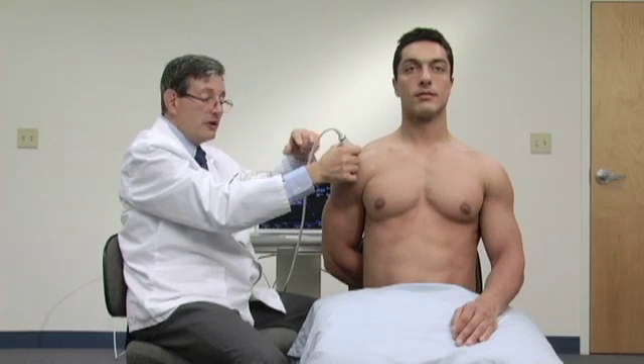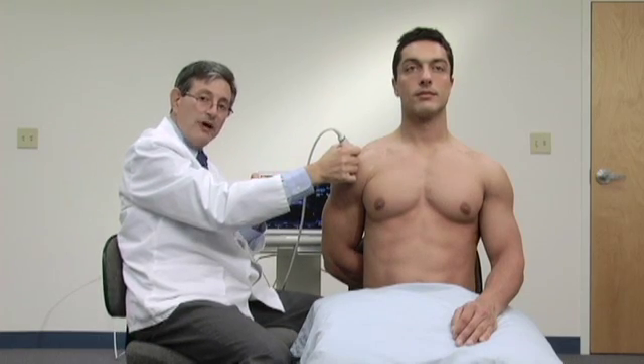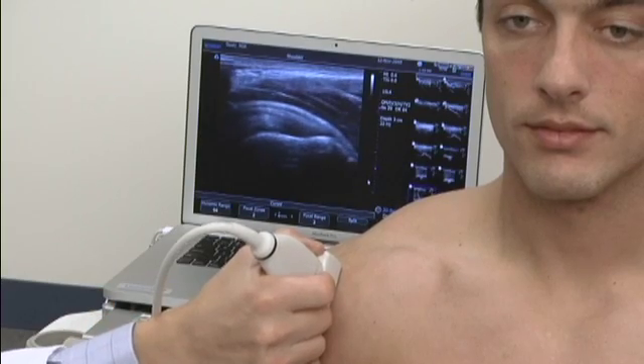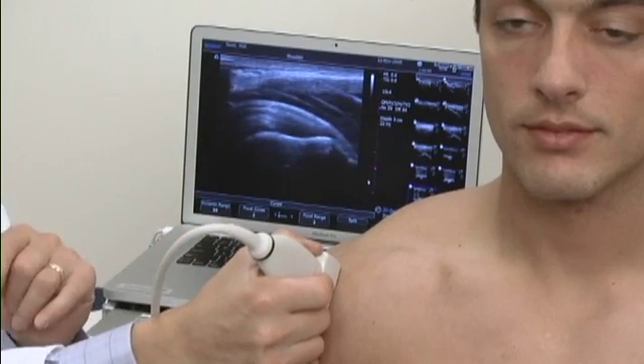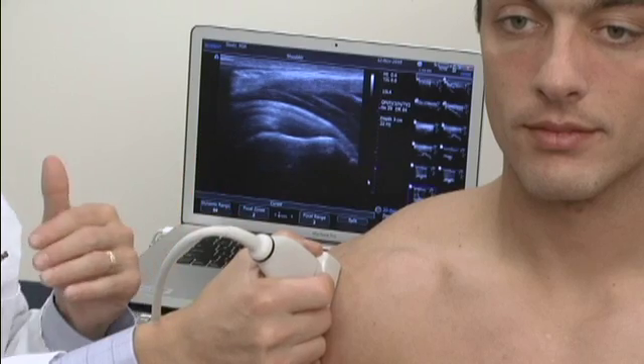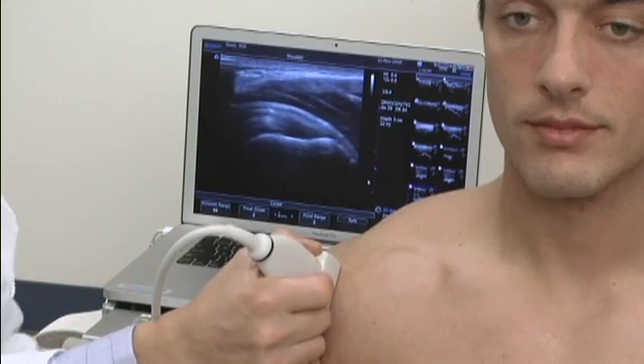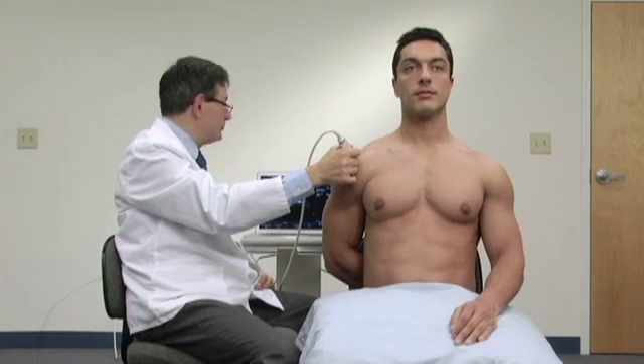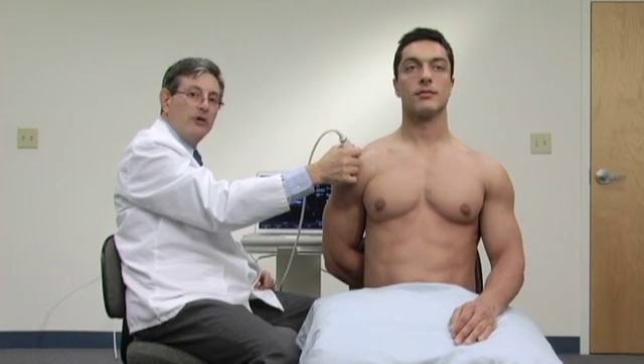Remember, this tendon is about 2.25 centimeters wide. So in order to see it, we need to go across it and see the whole amount. We need to go anterior and posterior if we were in the neutral position, but since we brought this tendon forwards, we're going to go medial and lateral relative to his body to see the whole width of the tendon.